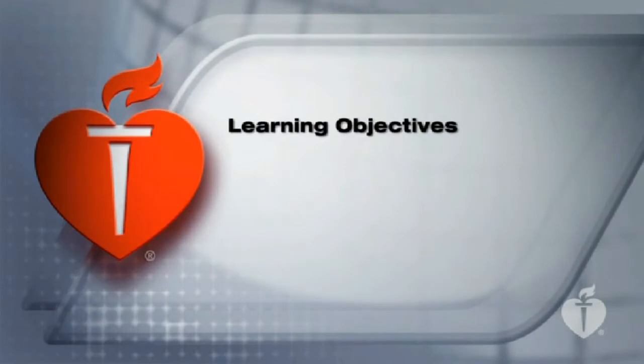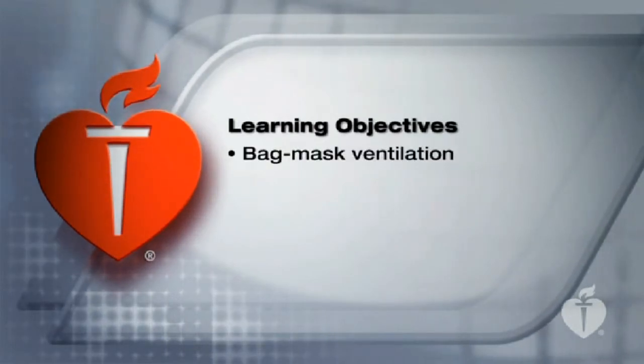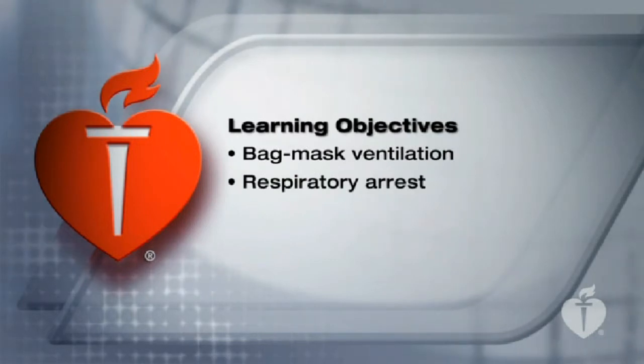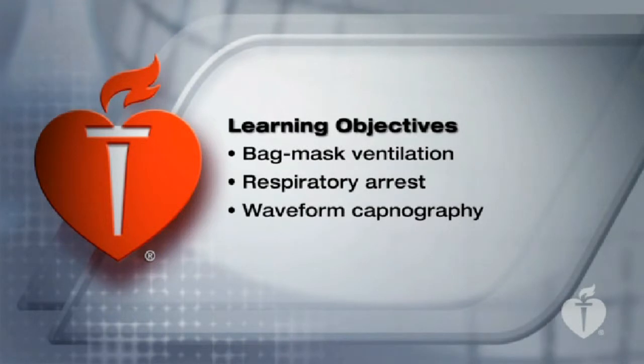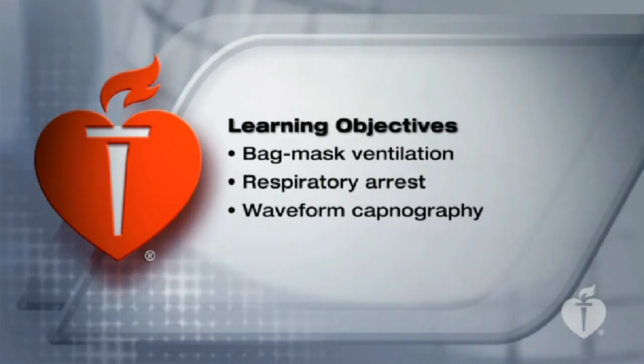scenarios and testing. We'll review and practice effective bag mask ventilation in both single rescuer and two rescuer scenarios. We'll review the steps in responding to a respiratory arrest and the recommended use of waveform capnography to monitor and confirm the placement of an endotracheal tube. Before we get into the specific airway skills, let's review the recommended ventilation rate for cardiac arrest patients.